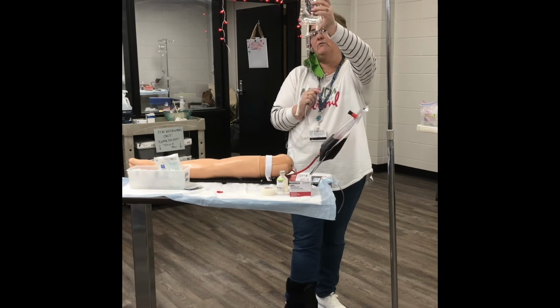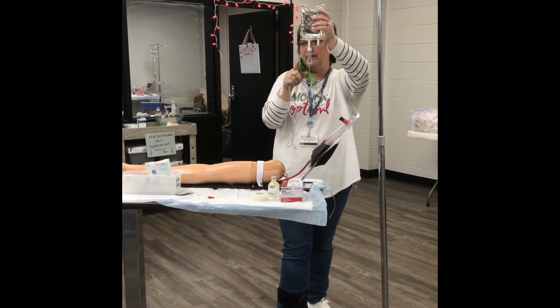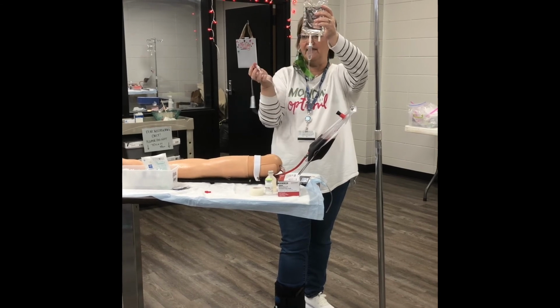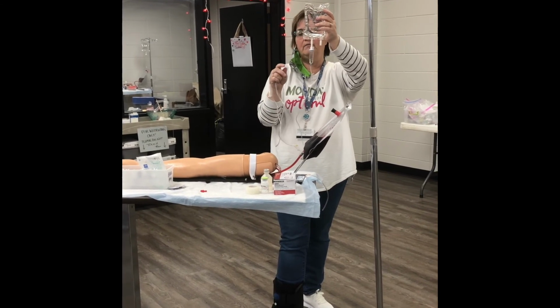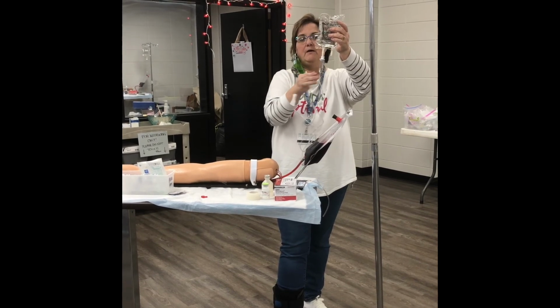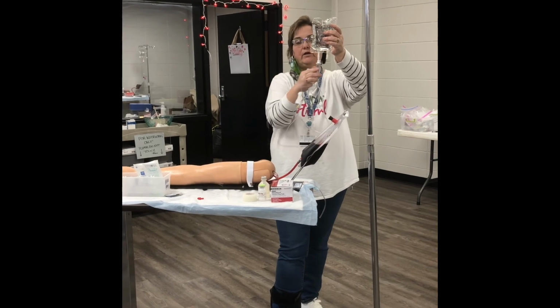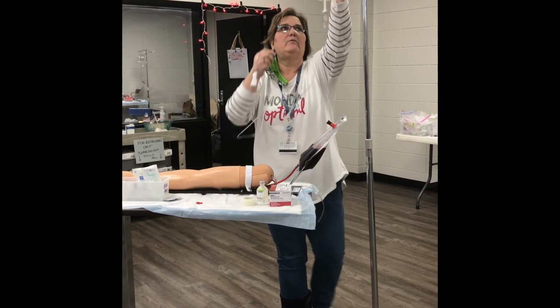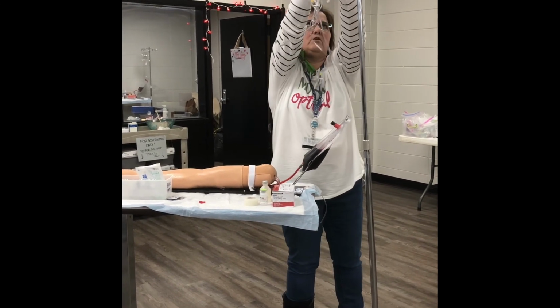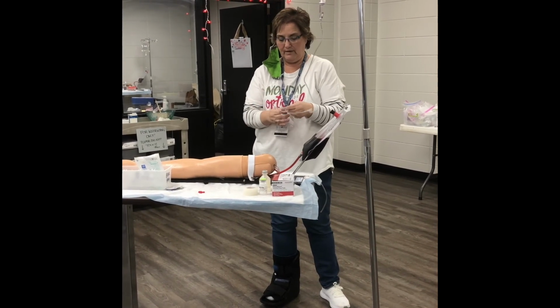If you squeeze it all the way hard, you can squeeze it one time and it'll fill up about 1/3 of the way, and that's good for this competency. You've got to count drops before you leave there, so you need to be able to see the drops. But it can't be down to here, because then you're going to get air. So it needs to be 1/3 to 1/2 of the way full. Then over the garbage can, or the sink, but we don't have any sinks in here.